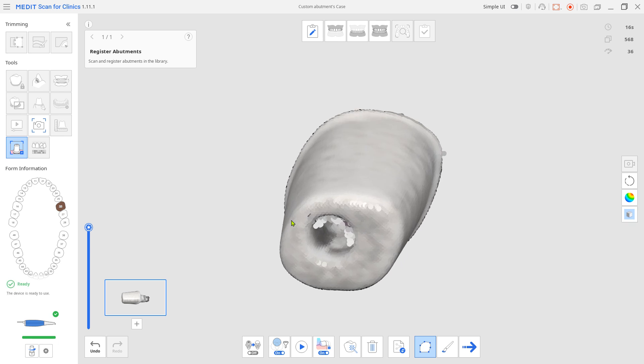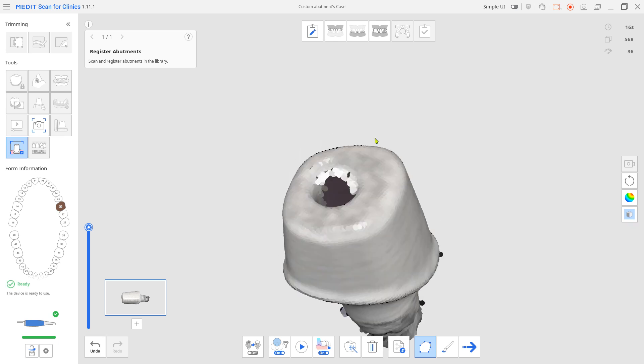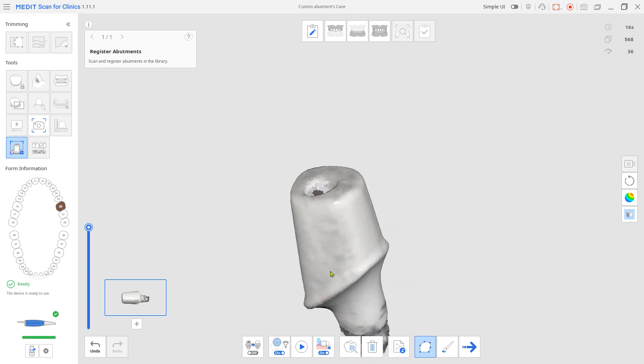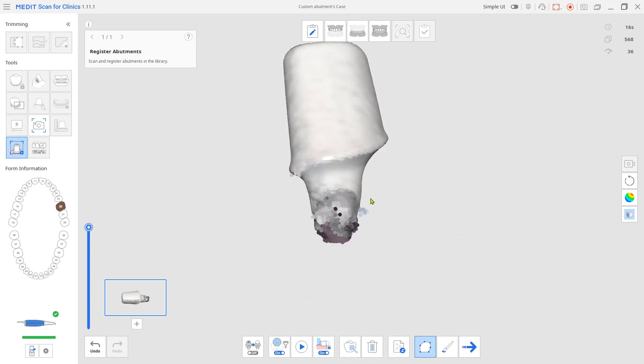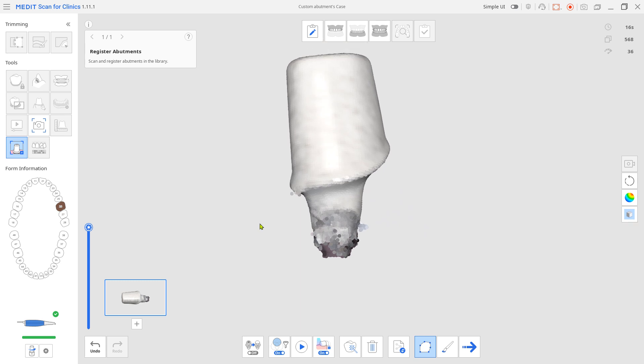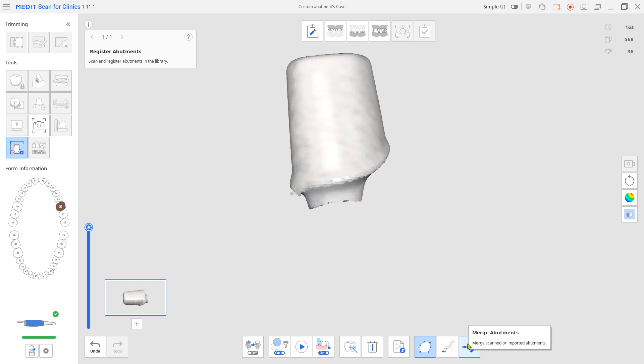Trim unnecessary area if needed. Click Merge abutments.